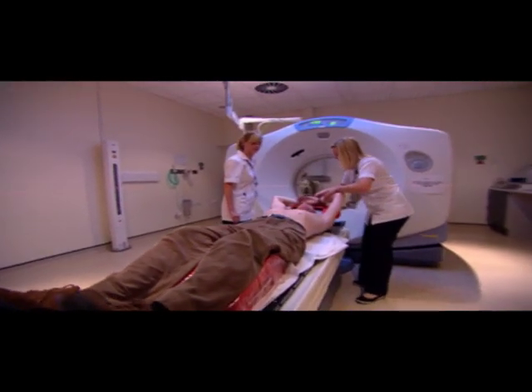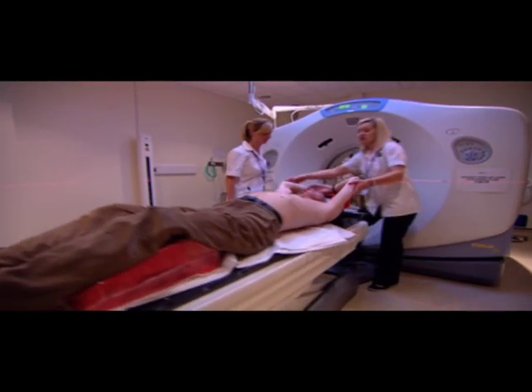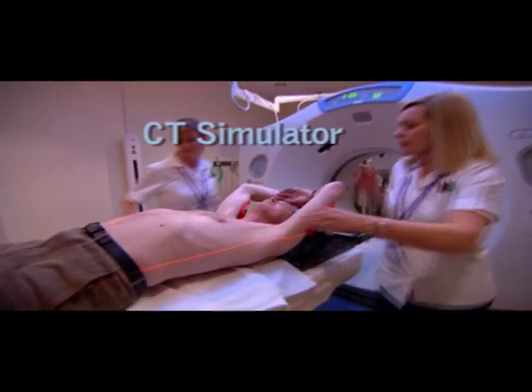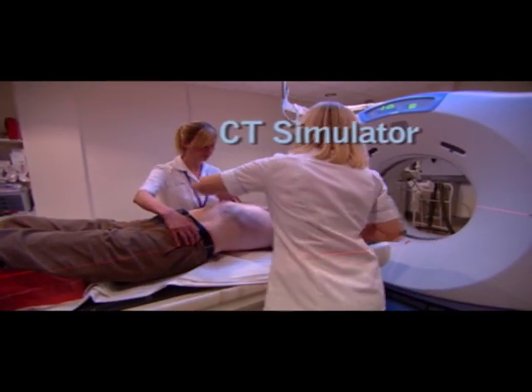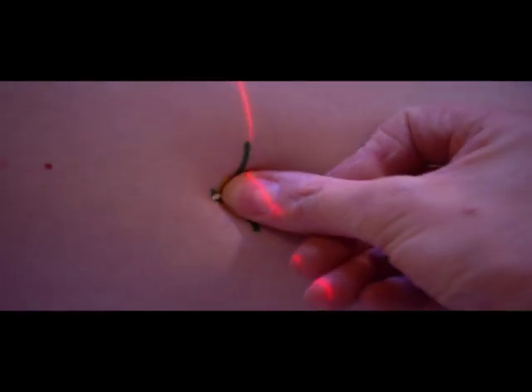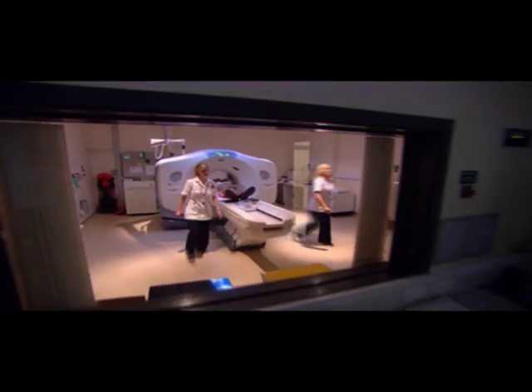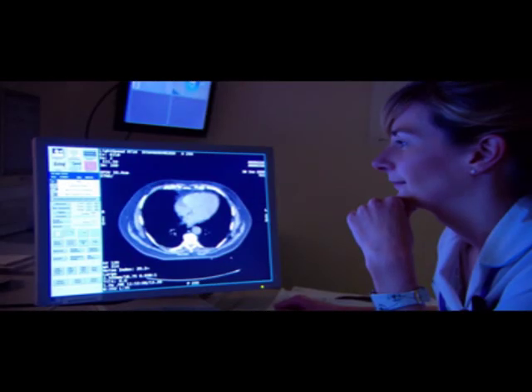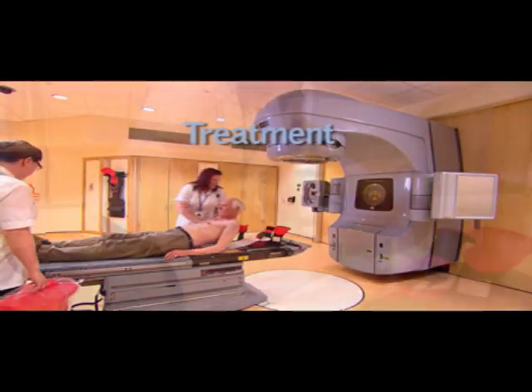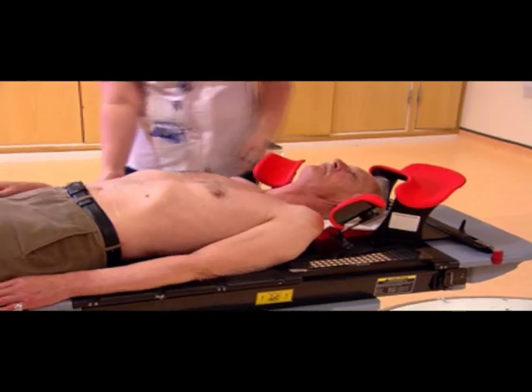Planning of the treatment is quite detailed and can take 2 to 3 weeks to sort out. The first part is a CT simulator. The purpose of this is to work out the exact positioning to get maximum results. So the radiographer often takes their time in getting it perfect. Once the initial scan is complete, the radiographer may apply a small permanent blue dot, no bigger than a freckle, so that they can make sure you are in the right spot every time. Treatment doesn't hurt at all, but the machine can be loud.